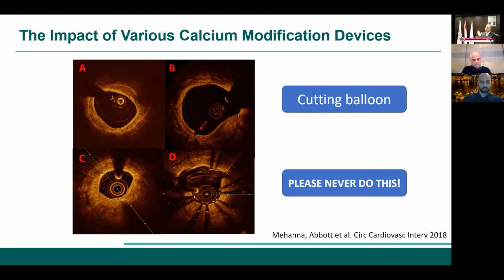You can't do any more atherectomies, the rotational, orbital, you name it. You will not laser or shockwave a freshly implanted stent. And a lot of the time, you just battle a bit with the balloon and then end up calling it a day, hoping it will not thrombose and that you will deal with restenosis later.